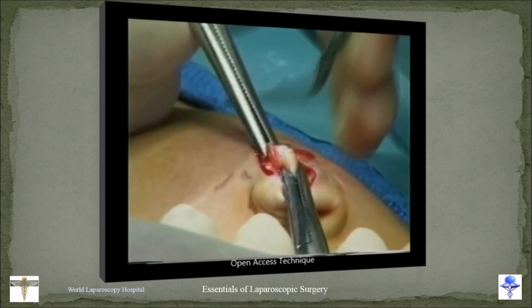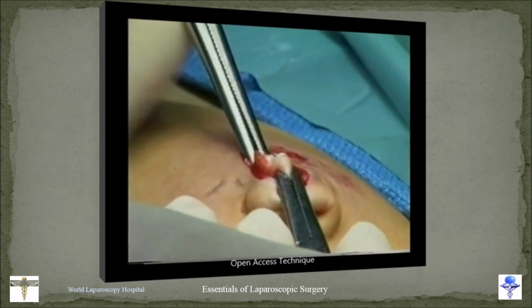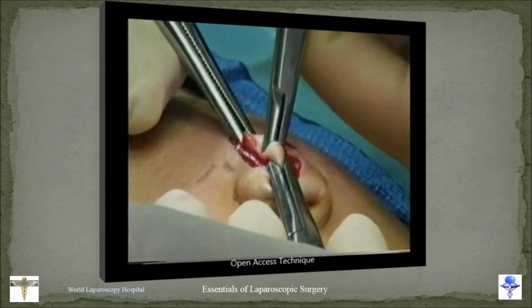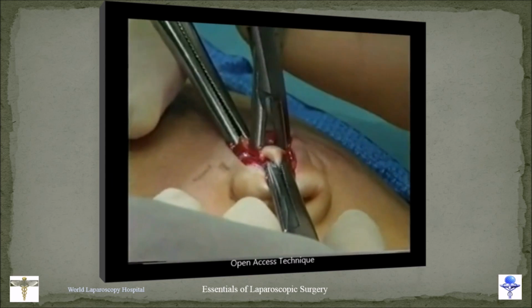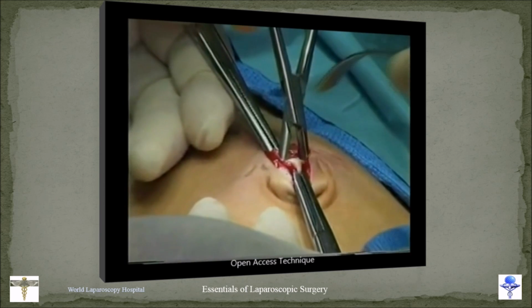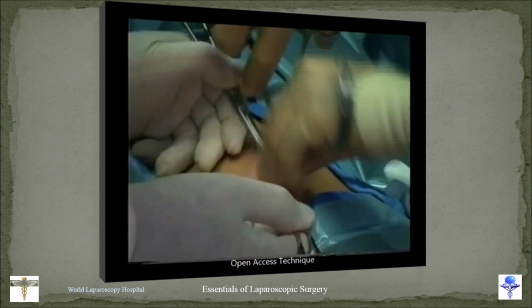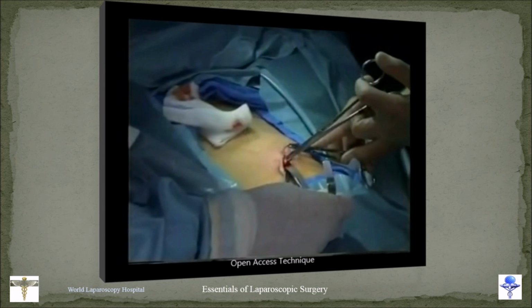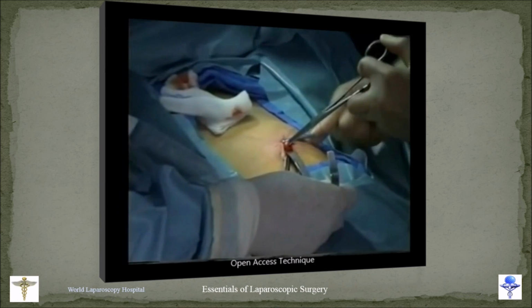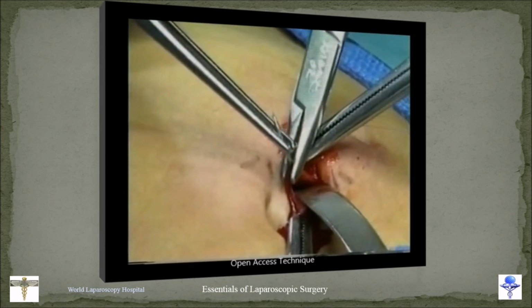If you have cut the skin longitudinal, then you can hold the rectus longitudinal, and if you hold the rectus longitudinal, you have to cut it transverse, and here it is cut transverse. Then, by opening the jaw of the mosquito, you are in, and then you can take an S clamp, a small S-shaped clamp. Rectus bite is important, either you do it in the beginning or at the end, because you have to stabilize the cannula.